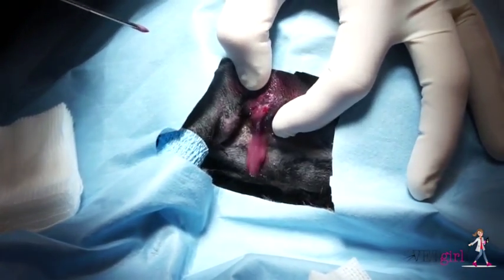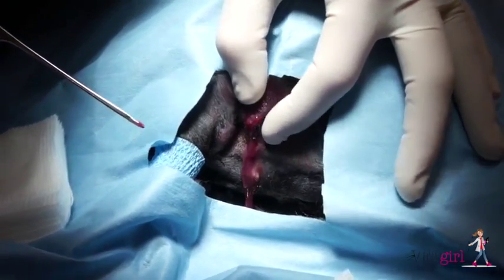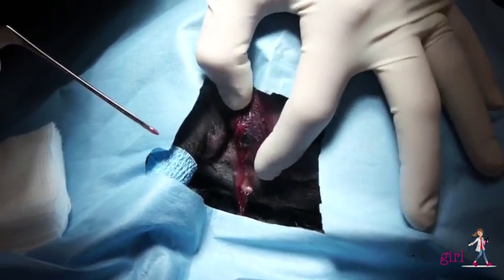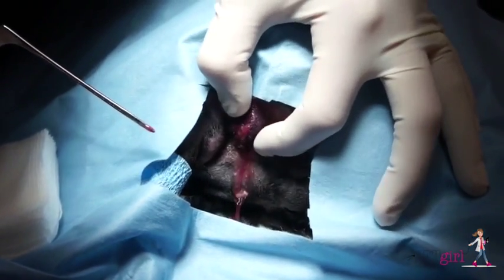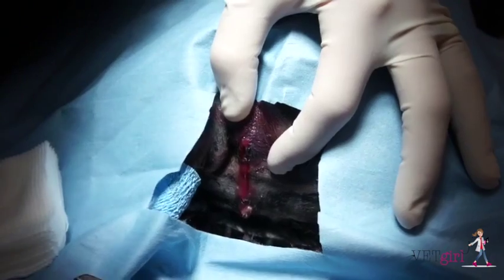Next step: making the necrotic lesion or opening wider so we can manually express and evacuate the purulent material.